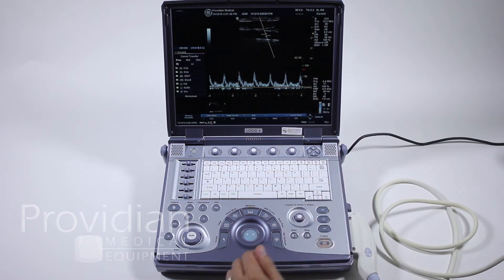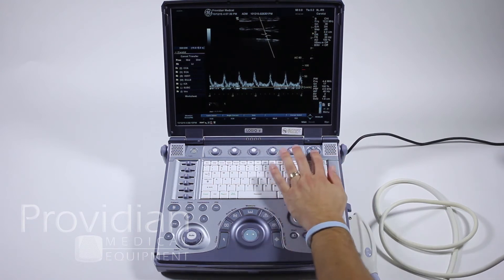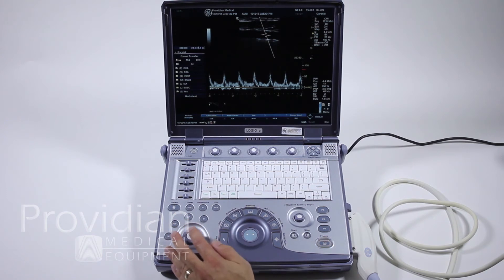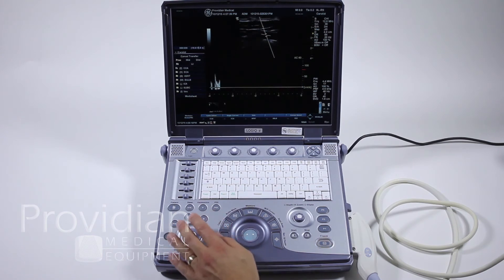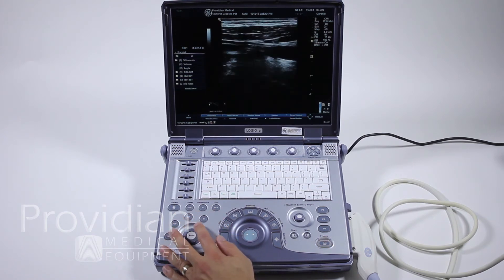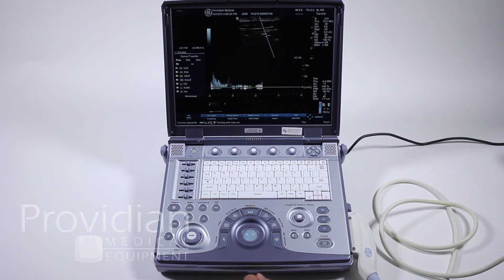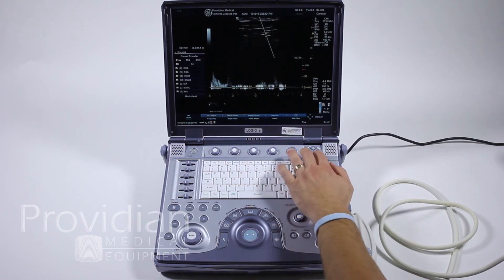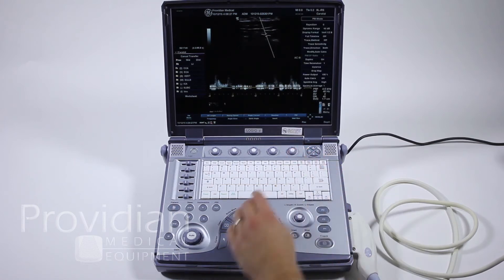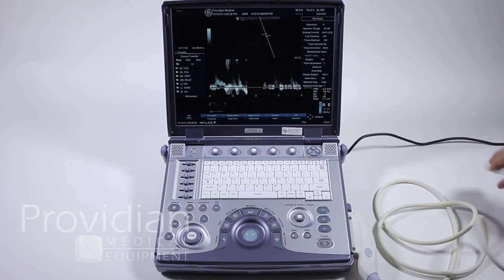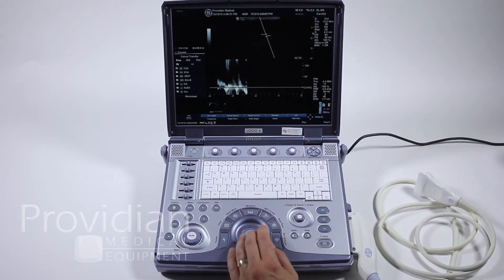There's also a set of parameters, and sometimes you'll see that menu and you won't know how to get back to it. I suggest going back to B mode by pressing B, then hitting PW again. It'll maintain the cursor, and you can go up here — you have a whole selection of parameters as we showed in 2D mode.